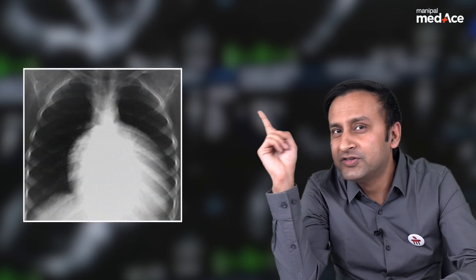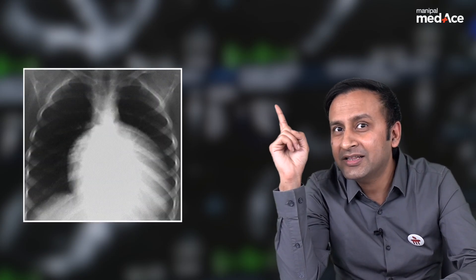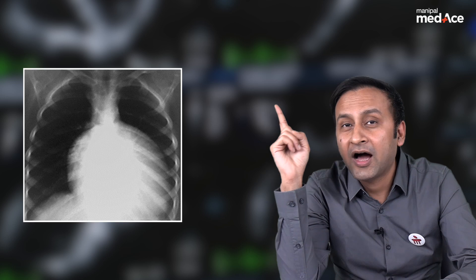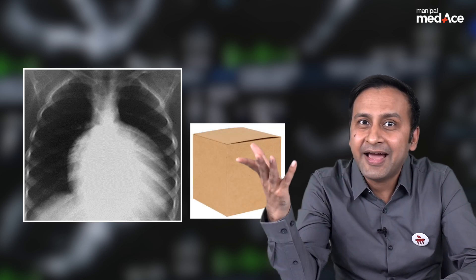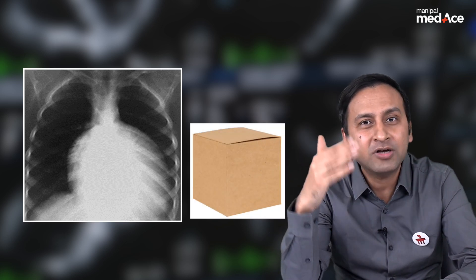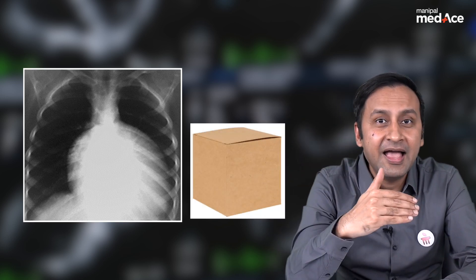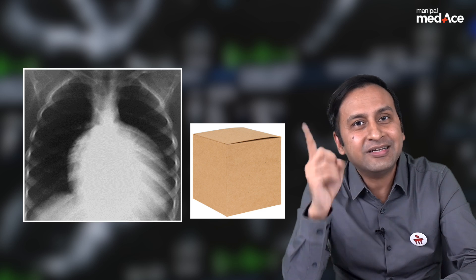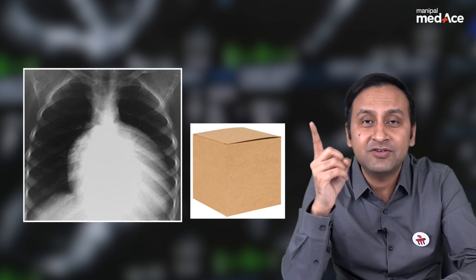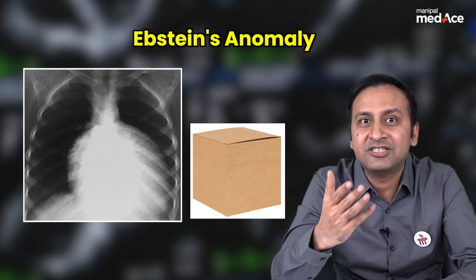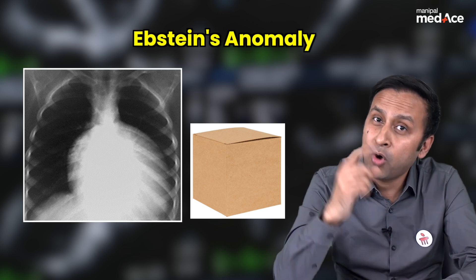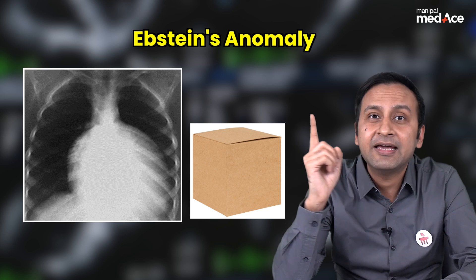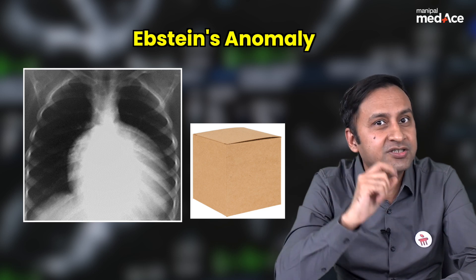Let's have a look at our second case. What do you see in this case? Look at the heart — it is typically looking like a box. Box starts with B, and there is only one congenital heart disease which has a B in its name: that is Ebstein's anomaly. So box-shaped heart is seen in Ebstein's anomaly.